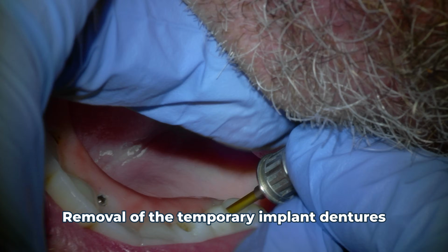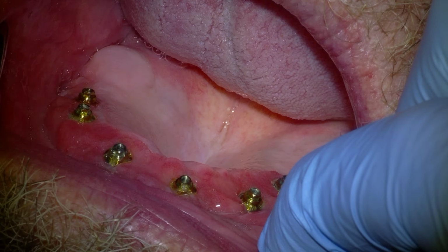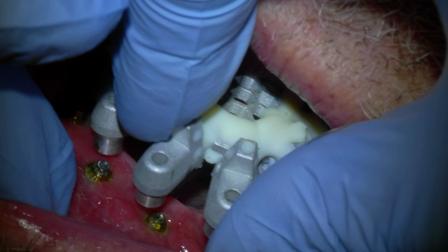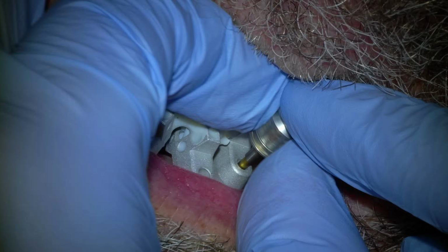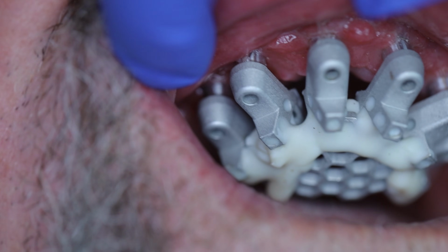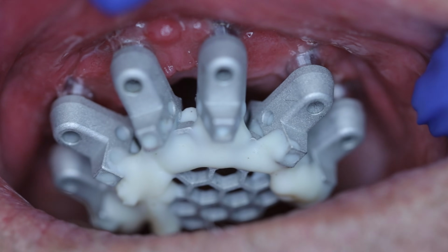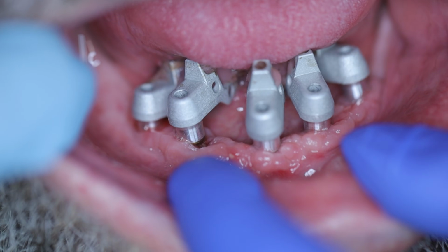We also want to confirm that everything is still in the exact place as far as the implants and abutments go. So we take that OptiSplint or verification jig that we made and have disinfected from the day of the surgery. If that fits in passively and doesn't break as we put it in, we know the implants and MU abutments are still in the exact same place. So we are now ready to take some more scans and remove the OptiSplint.